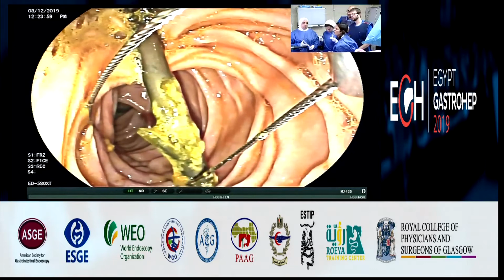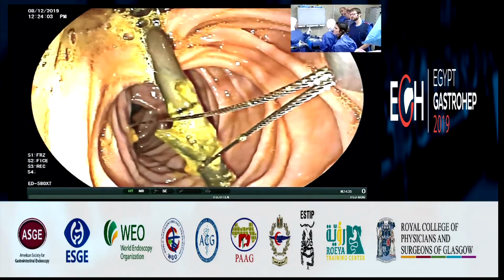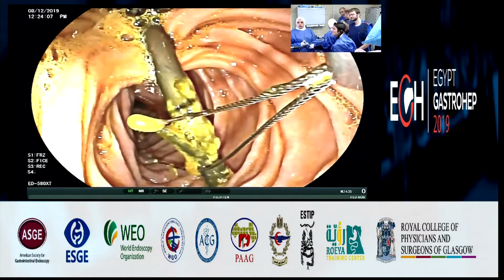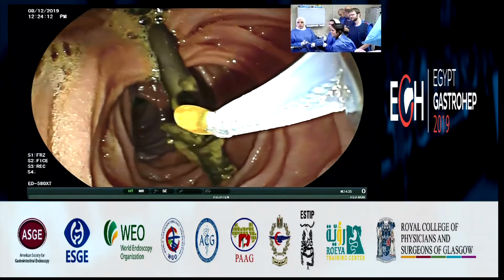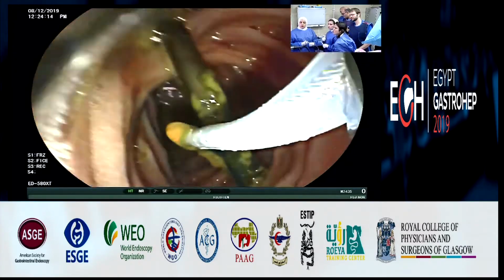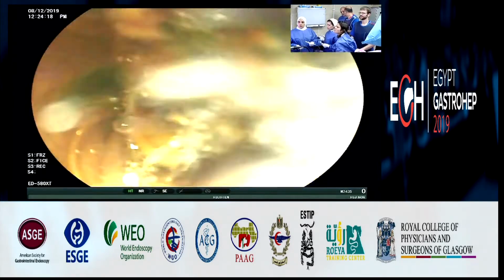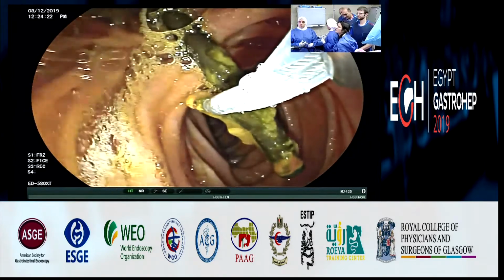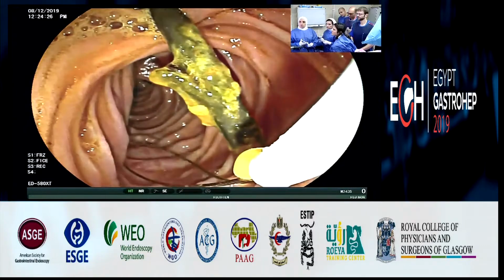Yeah, we can try that. Maybe just move it a bit more. But you can close a bit. Close, yeah. Like this? Maybe a bit like this to move it inside a bit to make some place. Okay, maybe release, and maybe we can try to grasp it from underneath now.